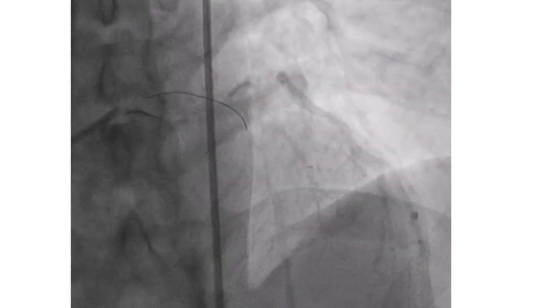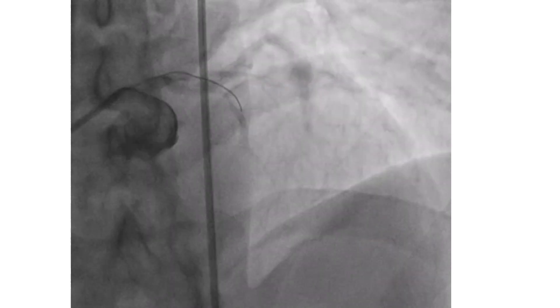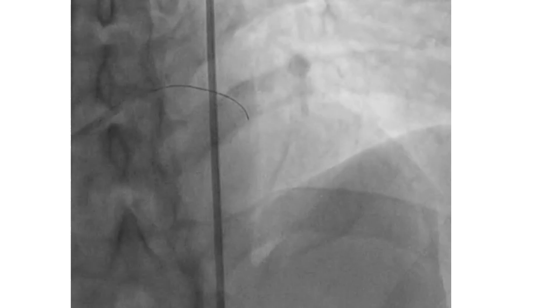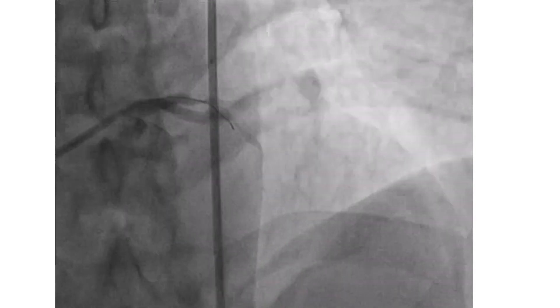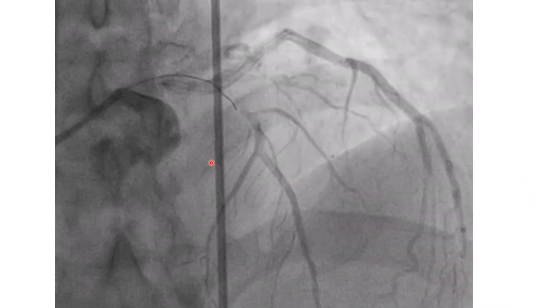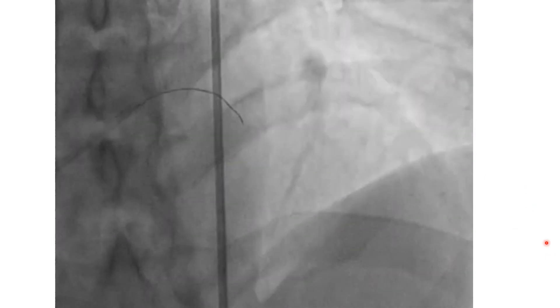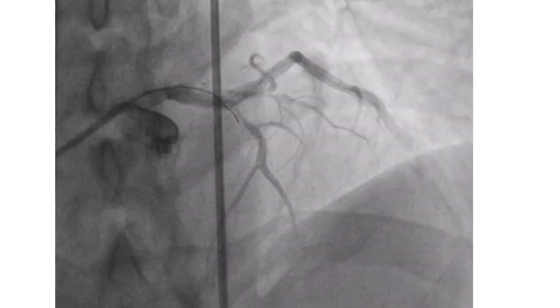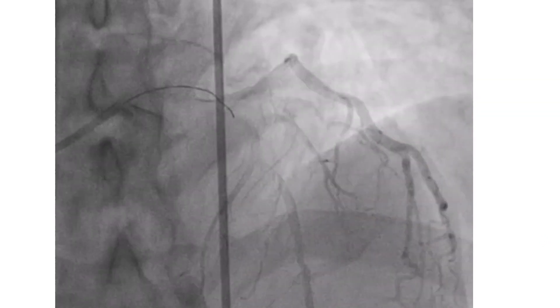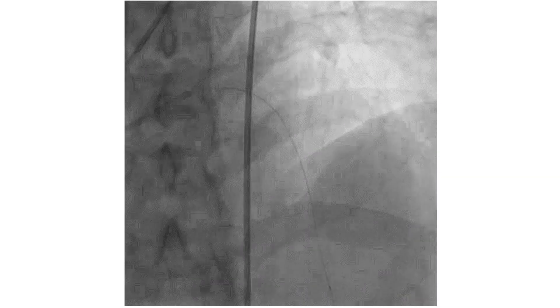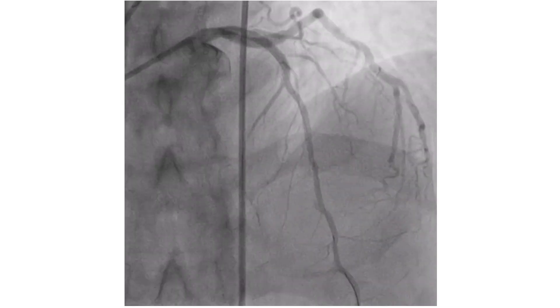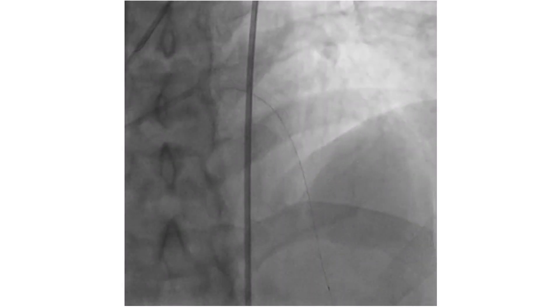Here we can either keep the wire in place and take another wire, or try to redirect the wire. Multiple redirections were needed in this case to pass into the true lumen. And then finally, it was successful in doing PCI for the patient.